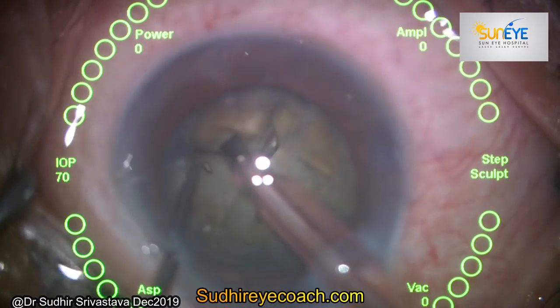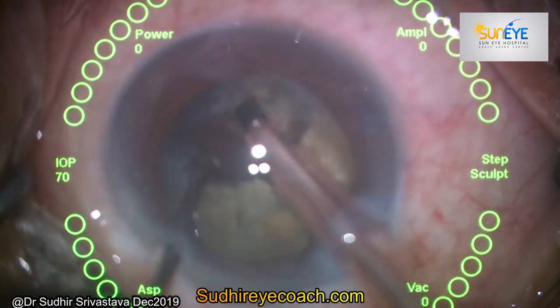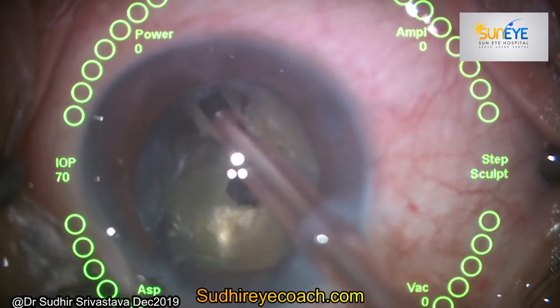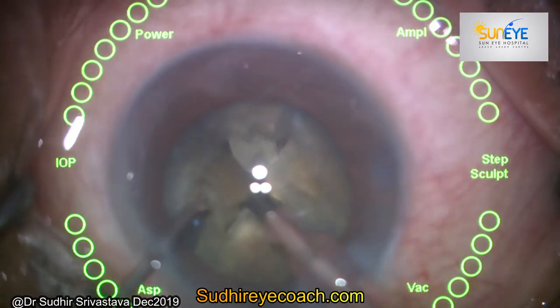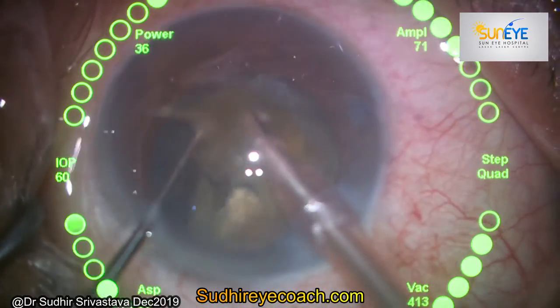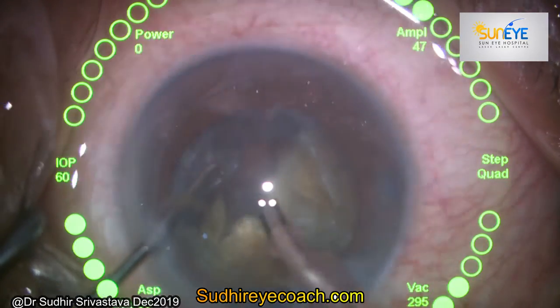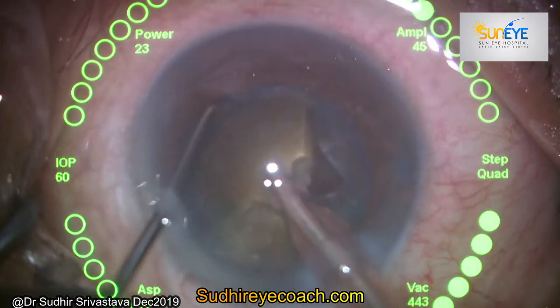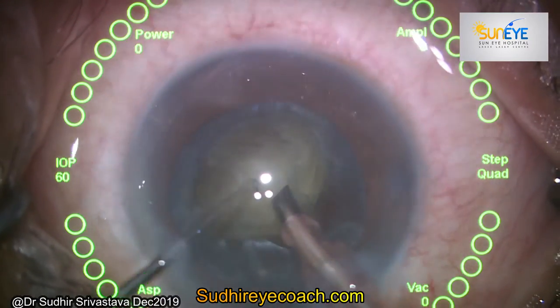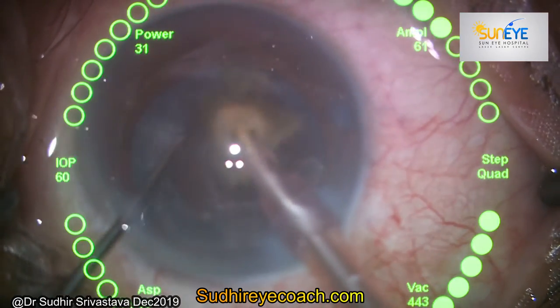You can see how easily you can split the quadrants. Rotate the nucleus again and split it into fragments. Now you have four equal fragments for phaco fragmentation. Grab one fragment, place it, and bring it to the level of the iris plane for safe fragmentation. Rotate the nucleus, bring another fragment to the iris plane level, and perform fragmentation. The fragments are loose and free in the bag, so you can very easily bring them to the iris plane level.